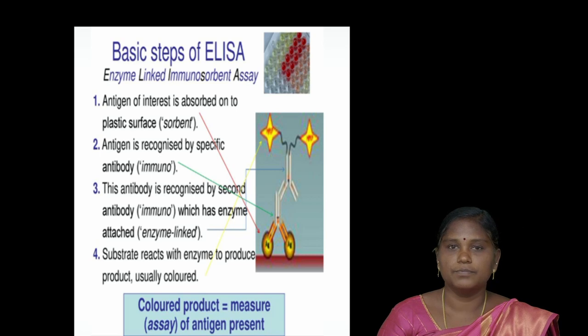The second step is that the antigen is recognized by a specific antibody, that is called immuno.